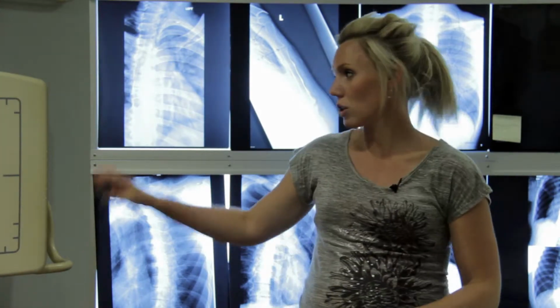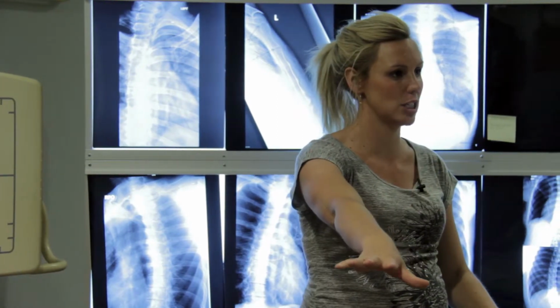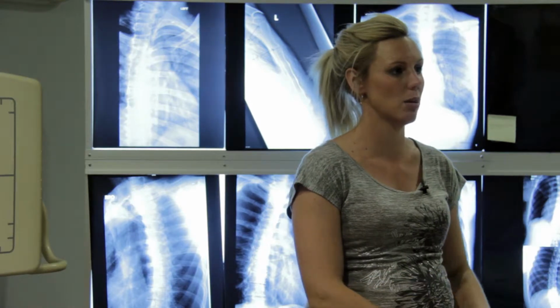So that's your 7 pictures. PA chest, 3 pictures standing, 3 pictures laying. Okay, it seems like it's a lot more effort and a lot more work, but there are a lot of things built in that make it easy. Your tube stays at 72 inches. When they're on the table, they're always on their back. You know, it's a lot easier to roll a patient on their back than trying to roll them around on their belly on the table.